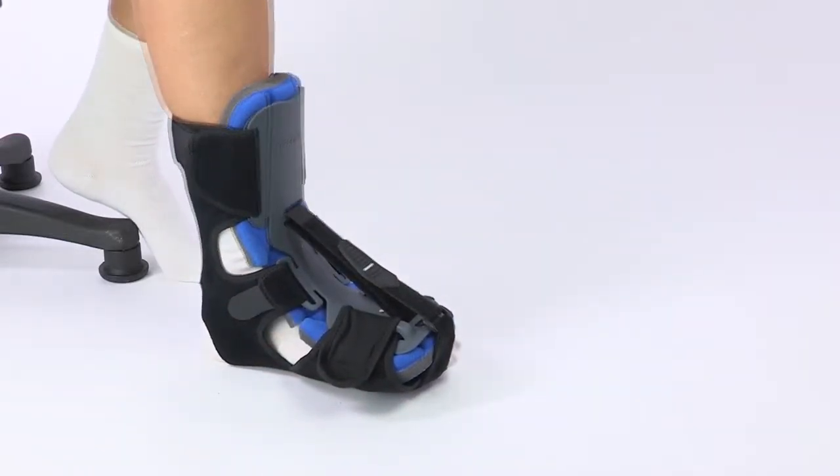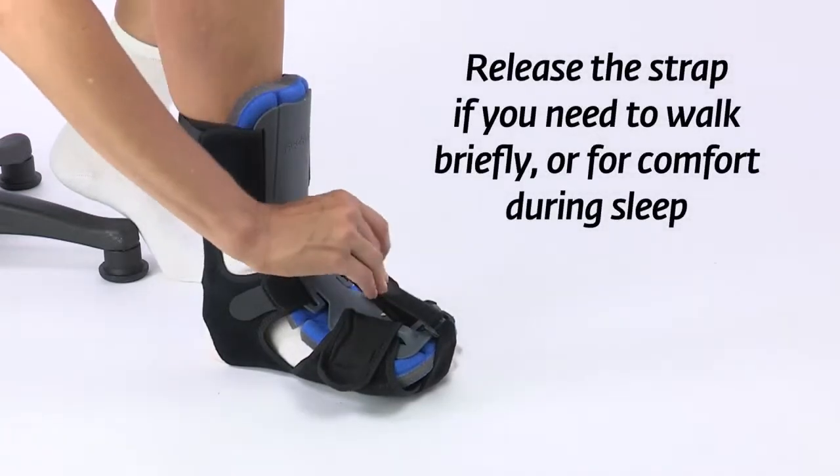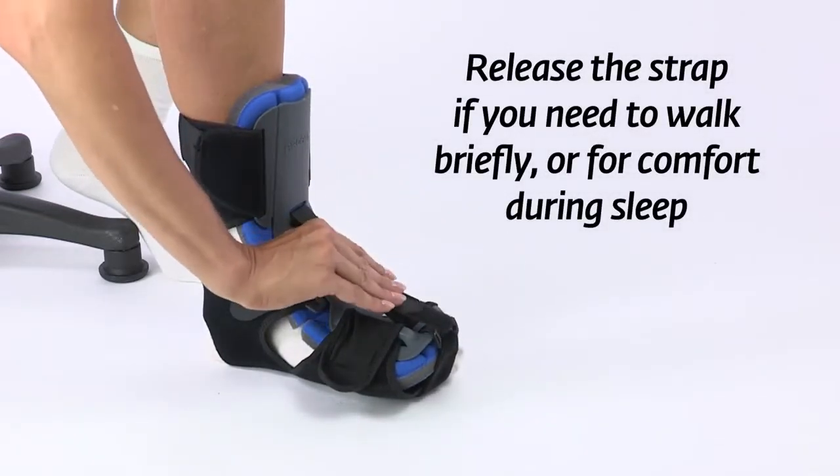Otherwise, you can remove the toe strap. Release the dorsiflexion strap like this if you need to walk briefly.